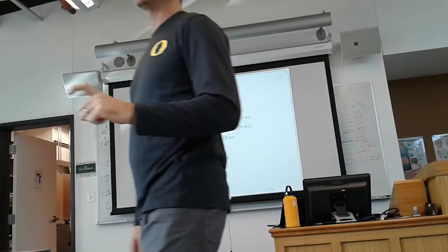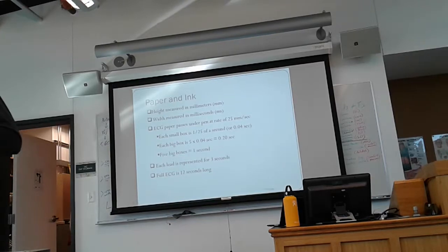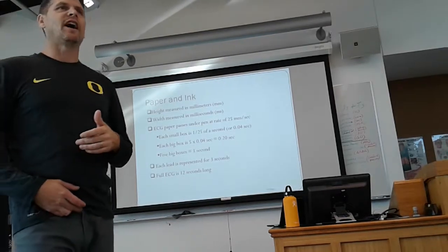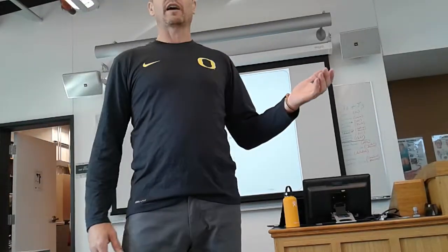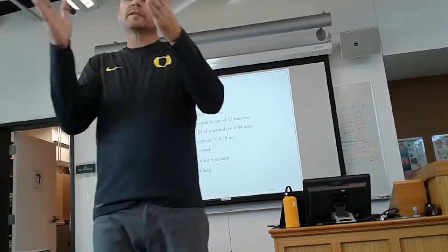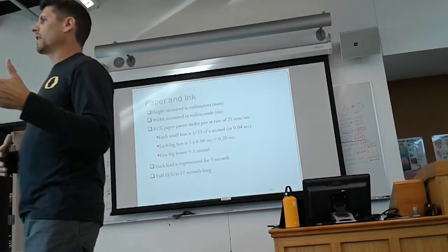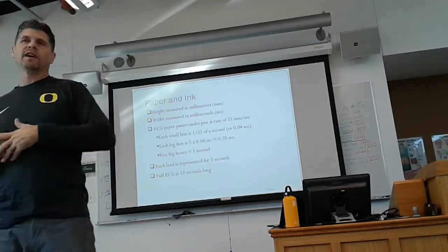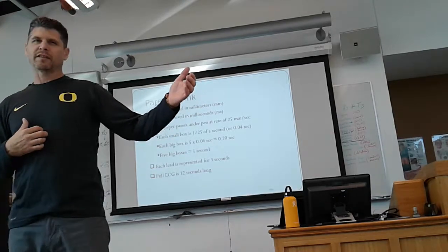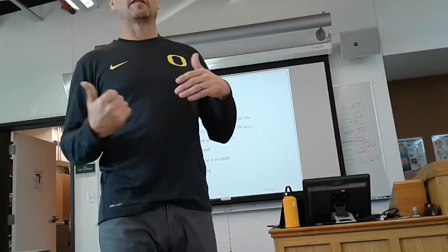A standard for us to look at single leads is in 6-second strips. I will tell you wholeheartedly that that is not adequate for a lot of rhythms we look at. But for a lot of rhythms we look at, it is. So it's the minimum time frame that you want to look at a single lead to be able to get enough information for you to then do an analysis on. Does that make sense?